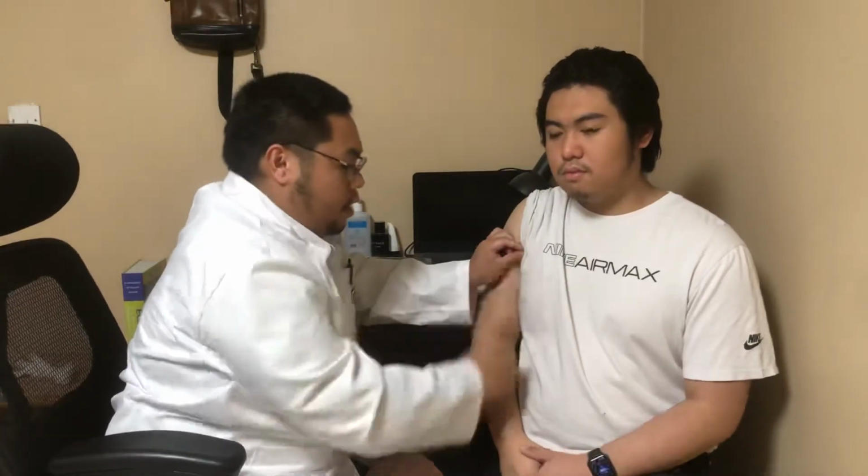Now, with the bulb of the thermometer, probe it in the middle, put the arm closer to the body, and then the forearm to the chest. Now, after this, wait 1 to 3 minutes, having the thermometer stationary in the middle of the armpit, or the axillary area, of the patient. After 1 to 3 minutes, take it off, wipe it dry, check the result, make sure to note it down in your notebook, and inform the patient of the result.